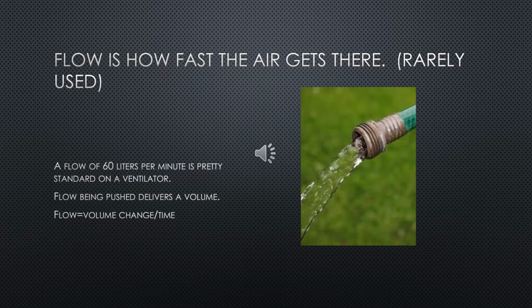Then we think of I time down the road. We'll talk about I time. Well, 1 second I time and 60 liters per minute, that makes math really easy. So that's why we did it, not because that's what the patient needed, right? Now ventilators will analyze this stuff for us and make it better. However, this is why and how that started. So you get a history lesson too. So you can put money in my tip jar when I get a tip jar.